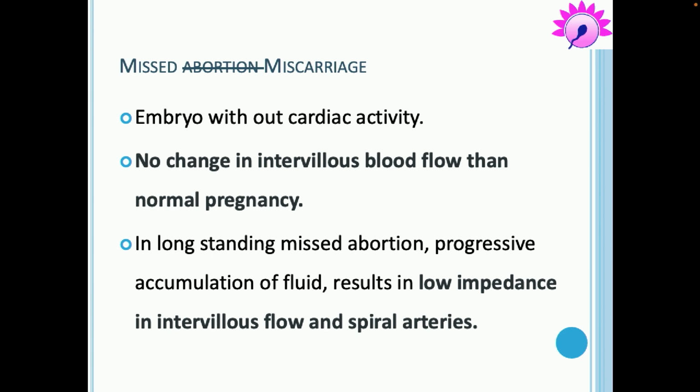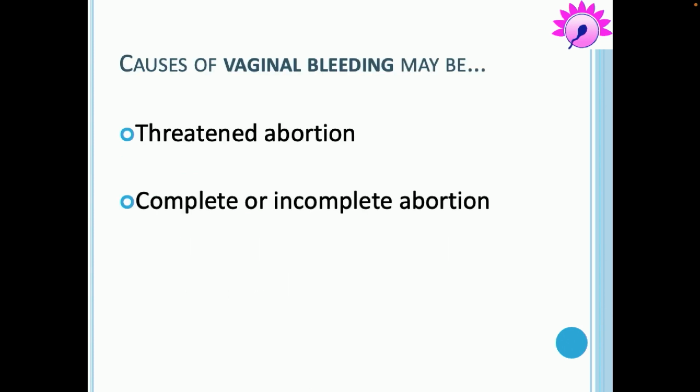Actually, when there is a fetus, there is a brake on the blood flow because it passes through a higher resistance, and therefore the perisac blood flow is controlled. But if there is no fetus, it is a continuous low resistance blood flow, and therefore it is in this case that you would see nearly normal blood flows or even lower resistance.